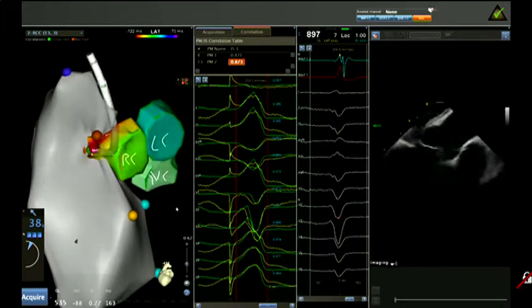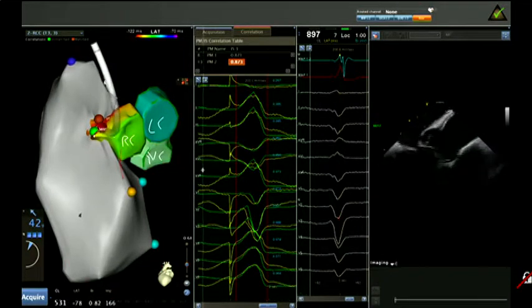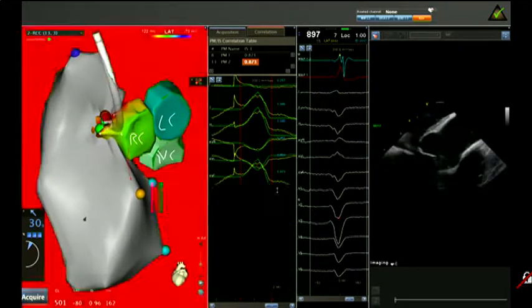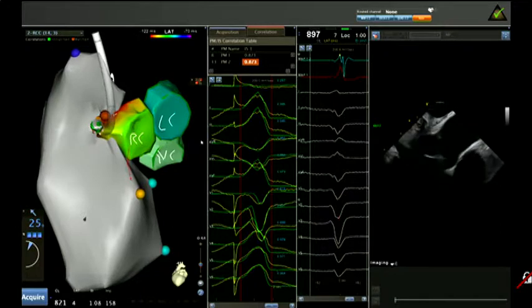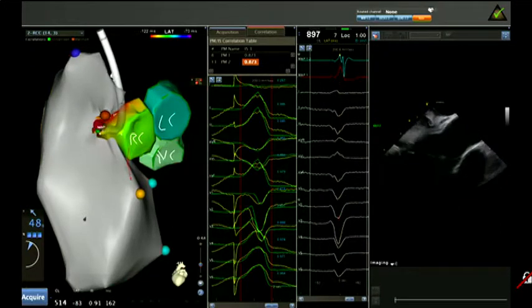Yes, absolutely. What is the place of the outflow tracts where you can feel better or safer about the information that the pace mapping is giving you, to guide your application over those places? To be honest, I usually rely more on the activation than on the pacing. I think pacing becomes more of a fallback when the PVCs are rare. But I really rely more on the activation.